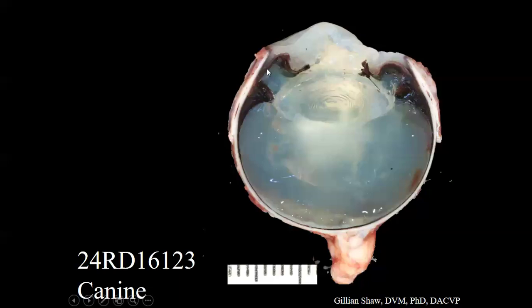And up here, you might be able to appreciate that bowing forward of this iris and its attachment to the lens right here. So this is that nice illustration of iris bombé. And it's kind of similar on the other side as well. When you look at the lens, most of it is fairly transparent, which is normal, but you might be able to appreciate a small opacity here.